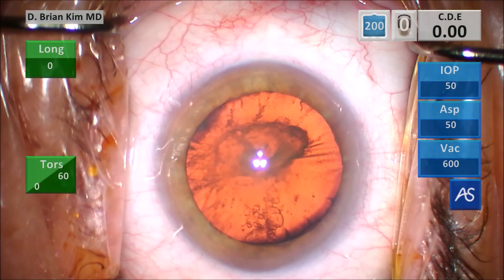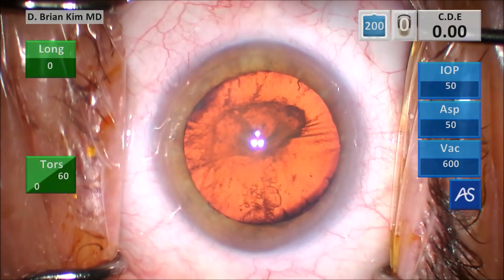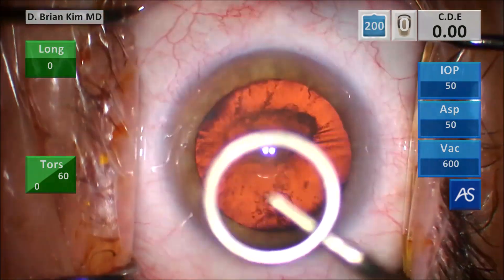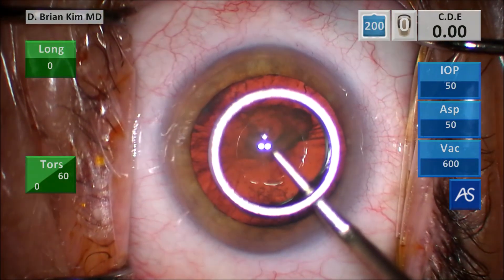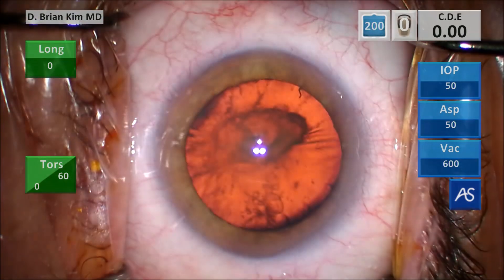Off the bat, you can see first there's a central area of lens fibrosis and you can see some areas of capsule stria. You can see right there some stria in the lens or in the capsule. Hard to tell, but that's an atypical sign. You don't see that in normal situations, and this gives me some indication that there may be some zonular laxity or zonular weakness.